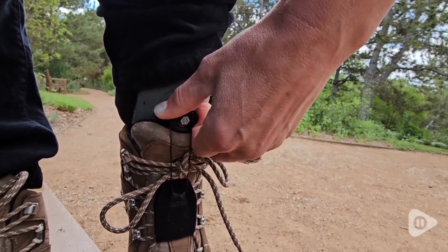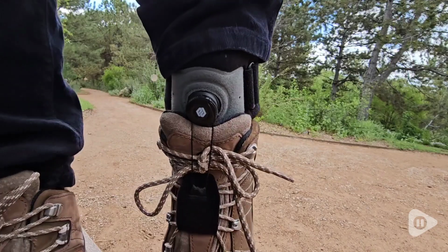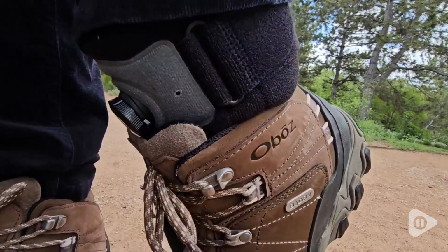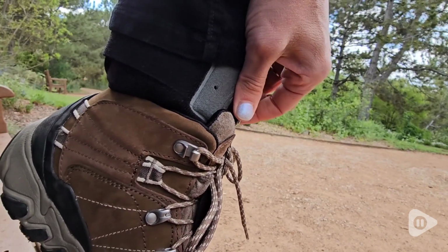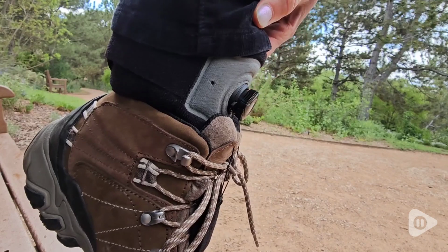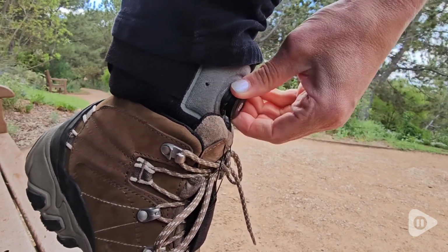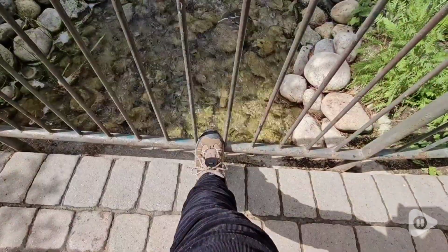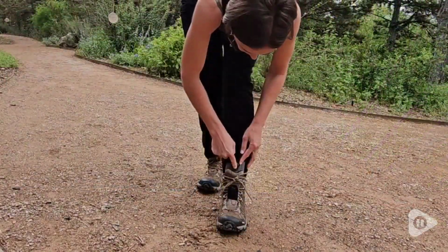You push in this reel, turn it clockwise to tighten it, and then it stays in place, providing me with that lift. One thing I like is how simple it is to use. To release, you just pull out the reel and immediately it releases the tension of the wire, and then you can unstrap everything.